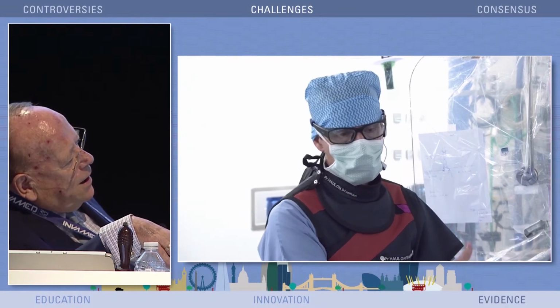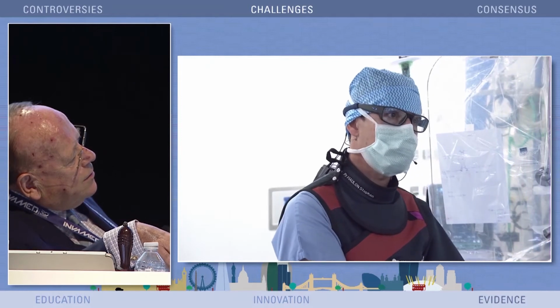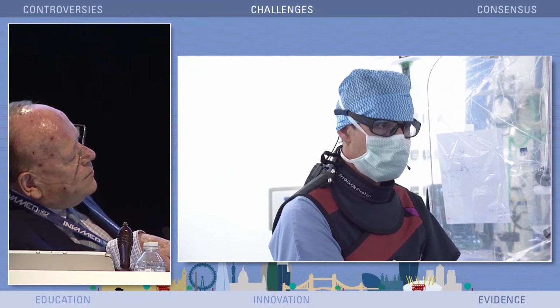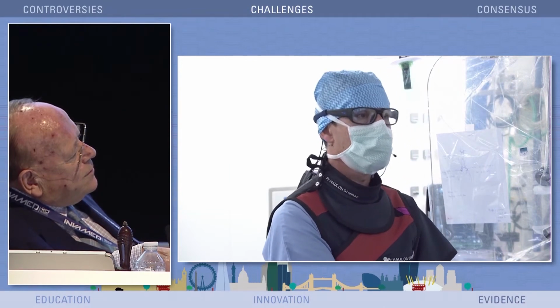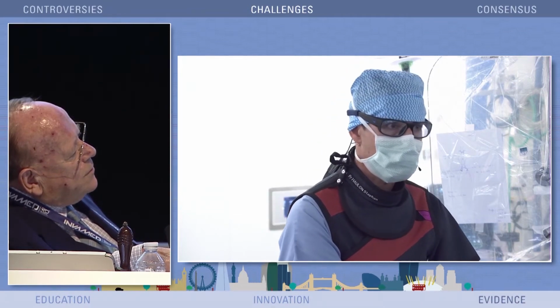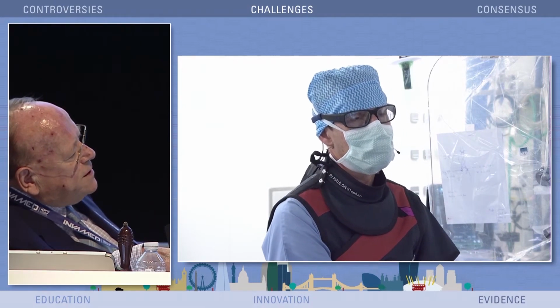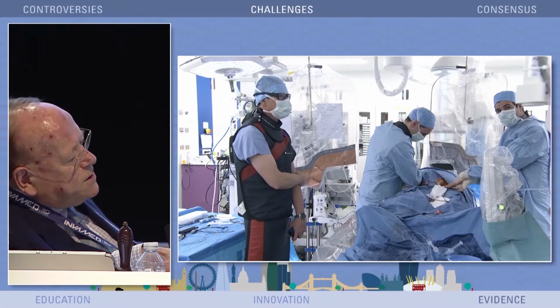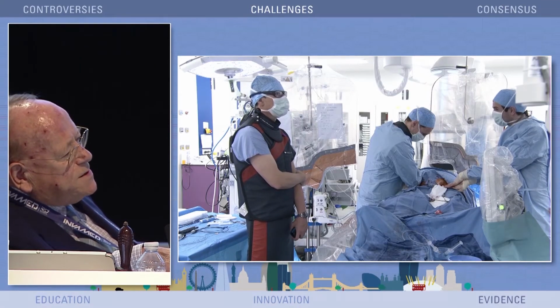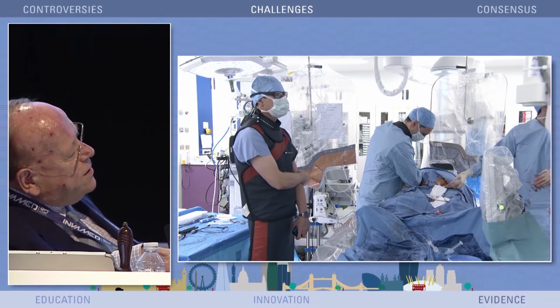And at the Mayo Clinic, Gustavo Oderich has really looked at and has big numbers to show that. And I think that is the way to perform correctly aortic endovascular repairs. And Stéphan, this is a basic endovascular repair, but Gustavo Oderich has used it for complex with multiple anastomoses and still using cone beam has got extraordinarily good results.